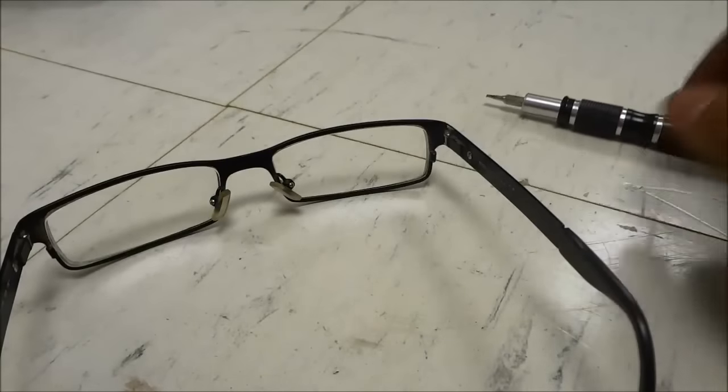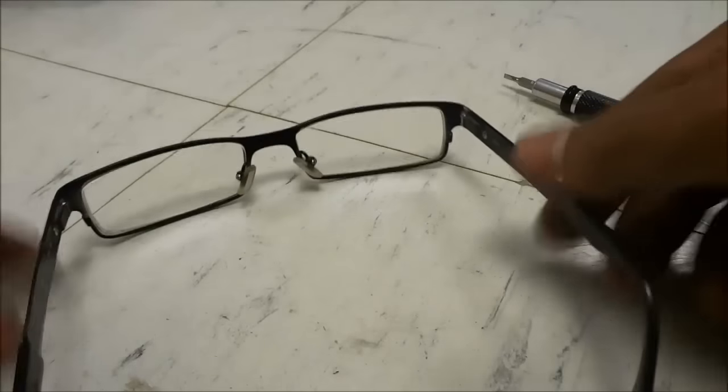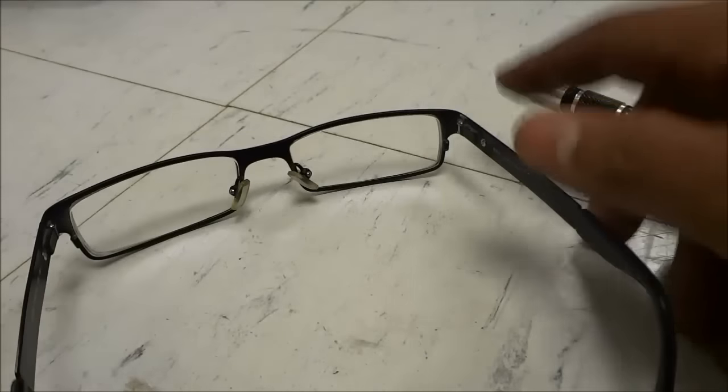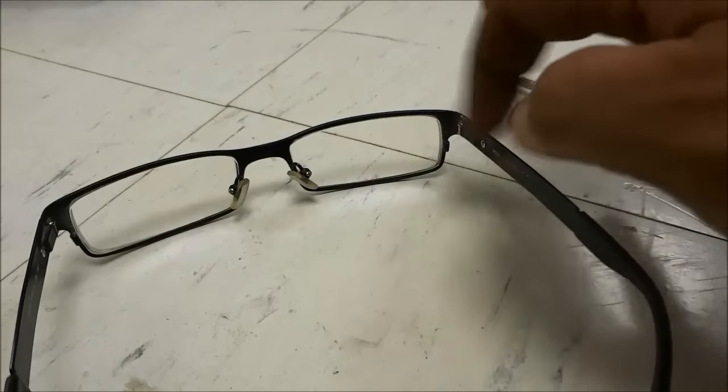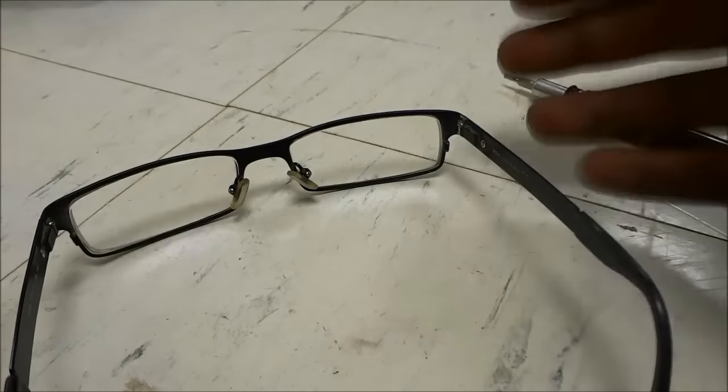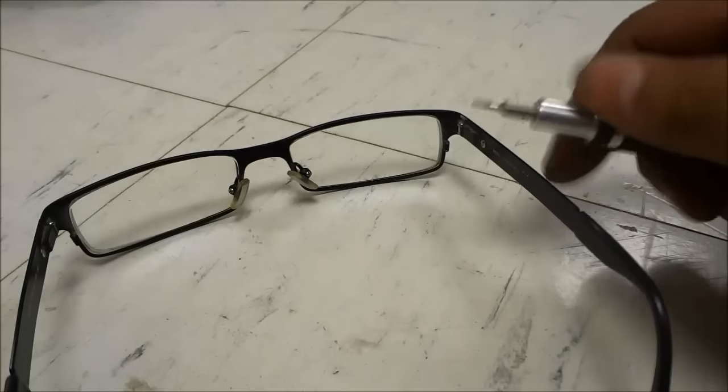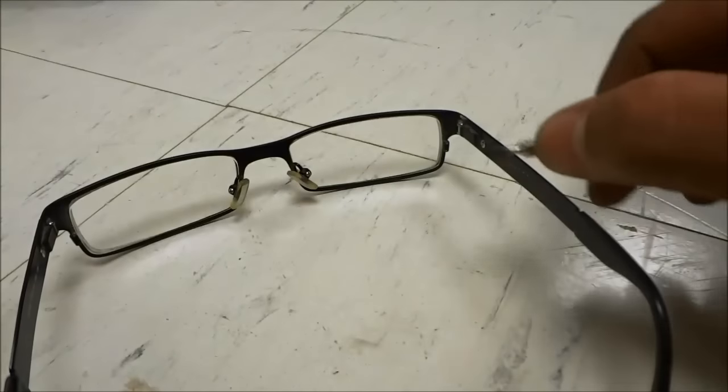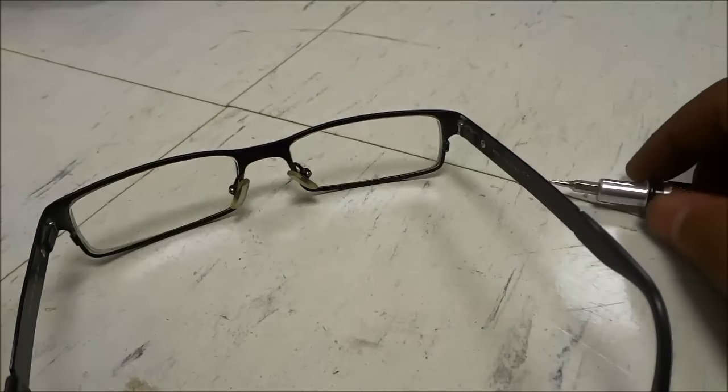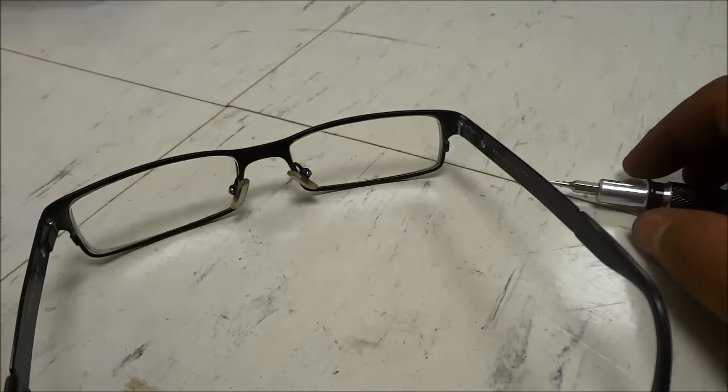So that's basically it. If you want to tighten your glasses, all you have to do is look for a small screw around the loose area and use a small screwdriver with a small screwdriver bit to tighten it. The process is really simple.